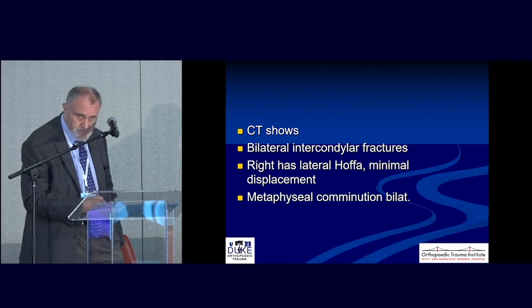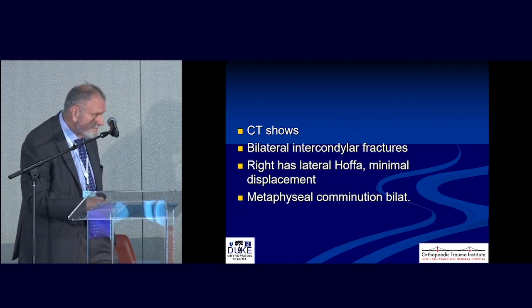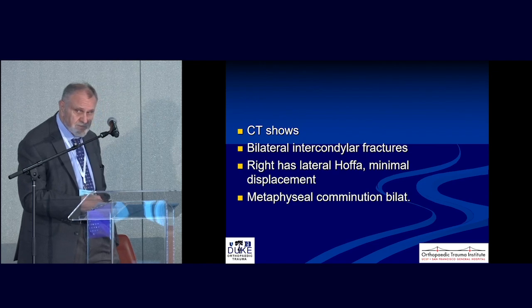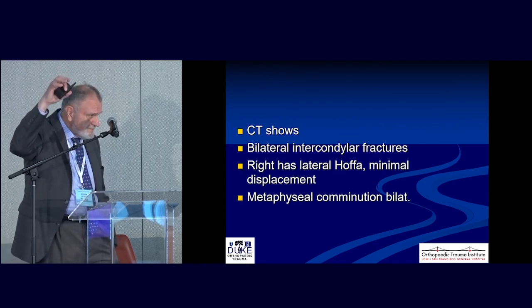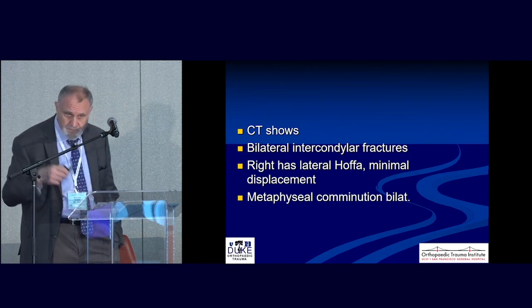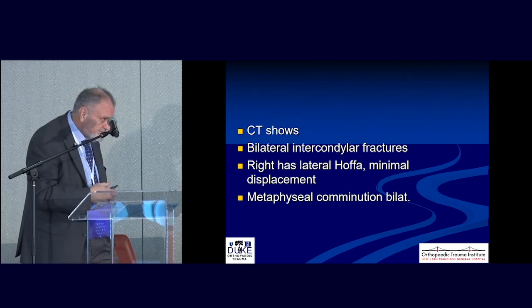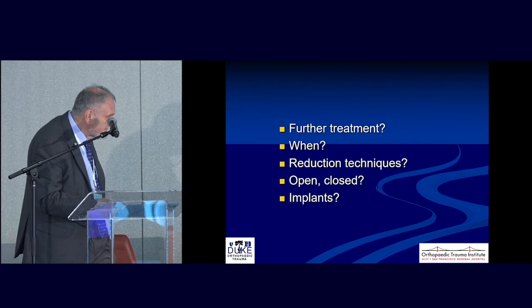Is everybody okay with that? No, I'm still anteromedial. I like anteromedial. Who wants to do anteromedial on the femur? No. Okay, who wants to go straight? I go straight. And who wants to go a little bit anterolateral? Okay, all right, so consensus is anteromedial on the tibia and we're going straight anterior on the femur. You guys got a lot to learn. All right, so what do we got, Steve?